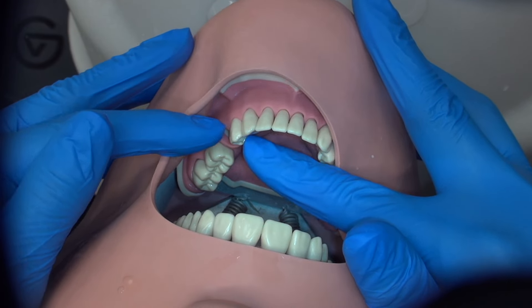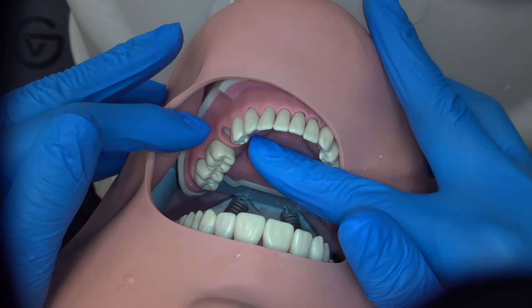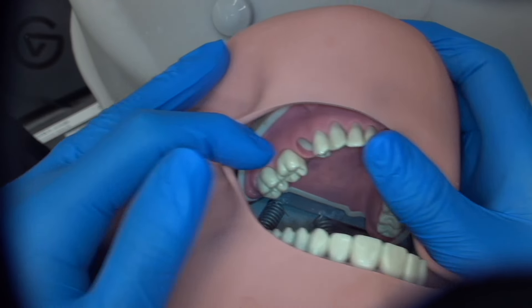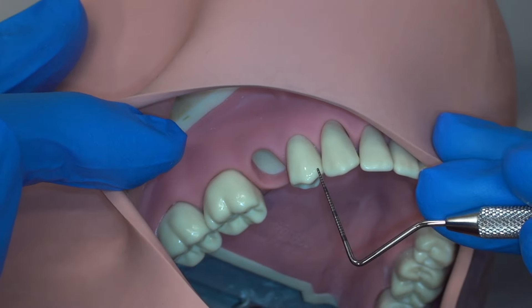Hi, this is Dr. Mora. Today we're going to be preparing a number 19 to 21 PFM bridge. Before we begin preparation, I want to talk about all of the different views that we will use to gain visual access to the different surfaces of the tooth.